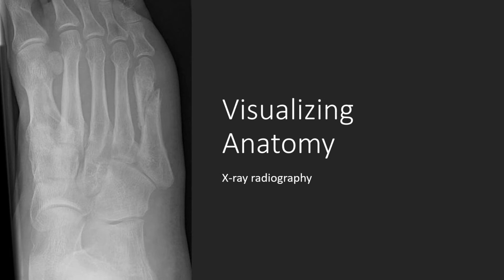Another thing is right there, that big crack in that poor person's foot bone. This is a metatarsal. So again, not your toe bones, but those long bones inside of the bulk of your foot. This is the pinky toe side, the fifth metatarsal side. And you clearly have, poor person, a nasty crack in that bone. They have a fractured fifth metatarsal.